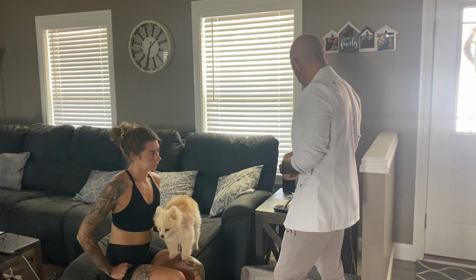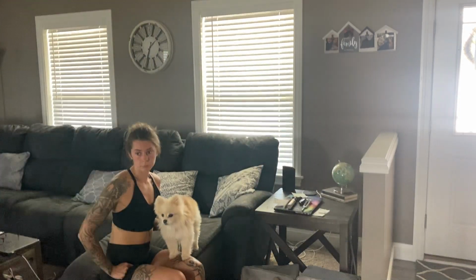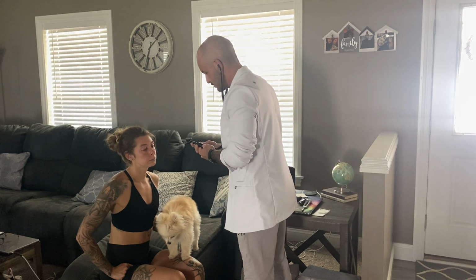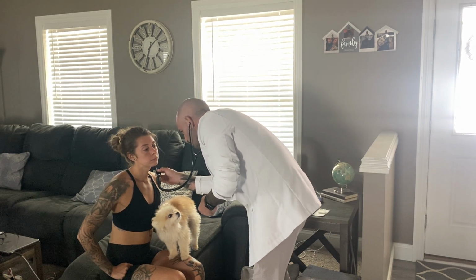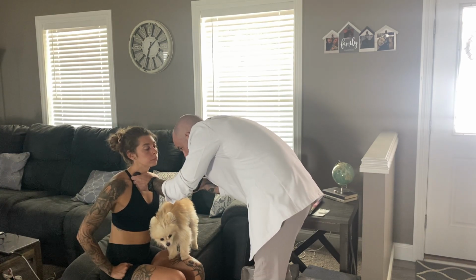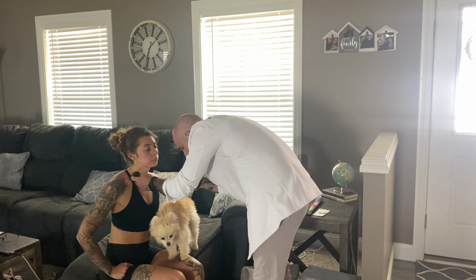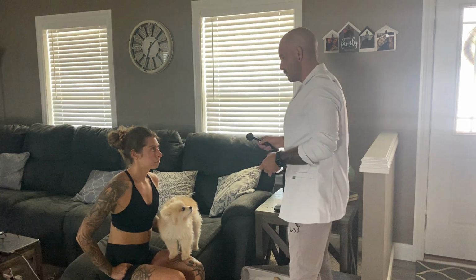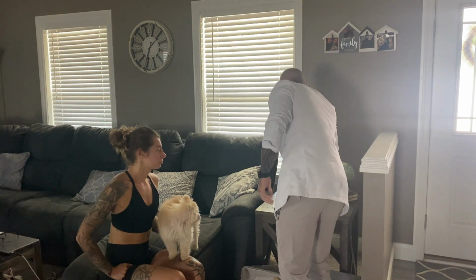I just have to grab my stethoscope. Okay. So I'm just gonna listen for carotid bruits. All right, and none were heard. That is all for this portion.